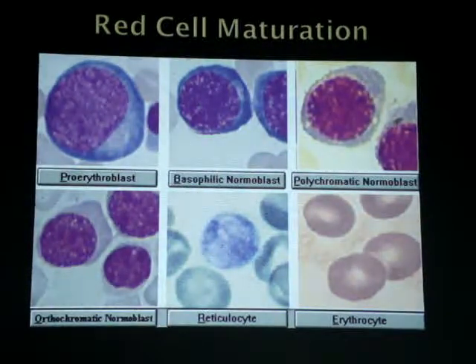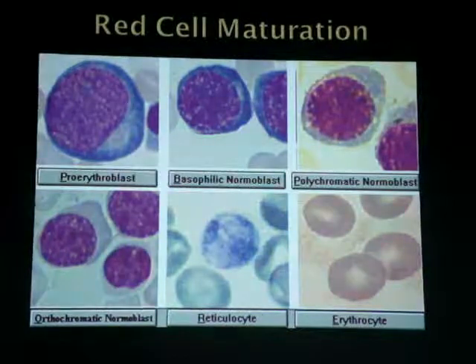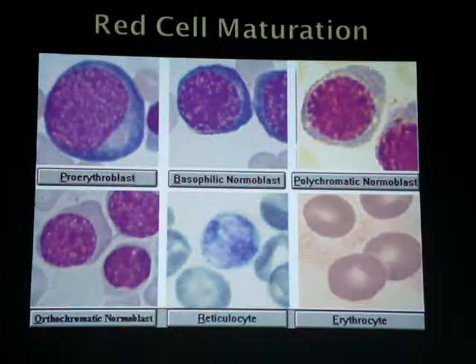Usually, cells that will produce red blood cells in the bone marrow are clustered together, and the stem cells destined to become white blood cells are also clustered together in the bone marrow cavity. That is why we will be able to see the precursors of the red cells amongst each other. Among the identifiable precursors of the red blood cells, the largest, according to their size, is the pro-erythroblast.